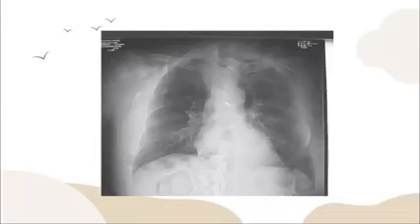So this can be corrected by pre-processing gihapon. Okay? So before siya i-display sa monitor, pwede siya i-edit sa computer, and kani siya electronic version sa inyong double exposure. Okay? If a CR IP has not been used for 24 hours, it should be erased again before use. Dapat yan 48 hours, pero as much as possible, 24 hours yun, i-erase na siya daan. Okay? Because, again, ghosting can occur.